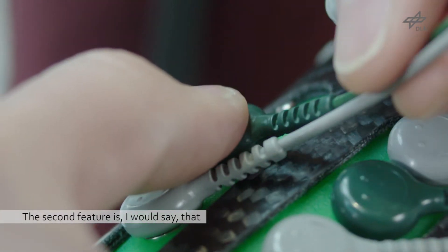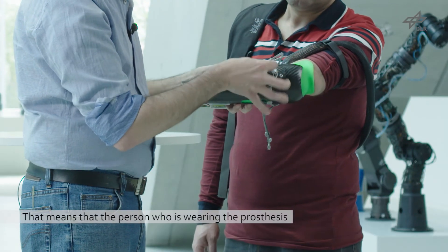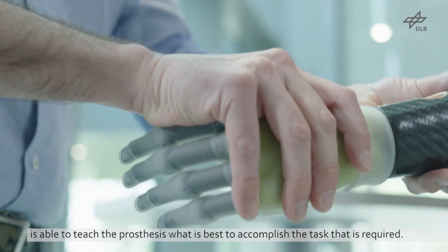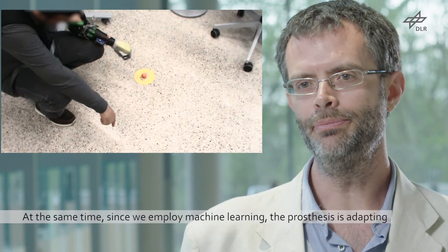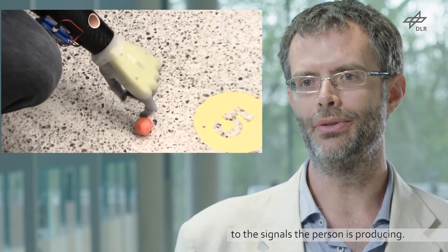The second feature is that we employ interactive machine learning for the control. That means the person wearing the prosthesis is able to teach the prosthesis what is best to accomplish the required task. At the same time, since we employ machine learning, the prosthesis is adapting to the signals that the person is producing.